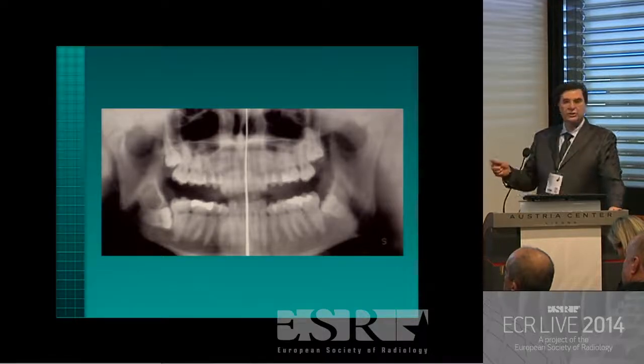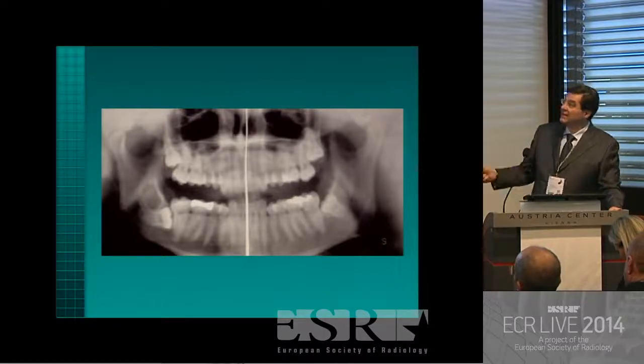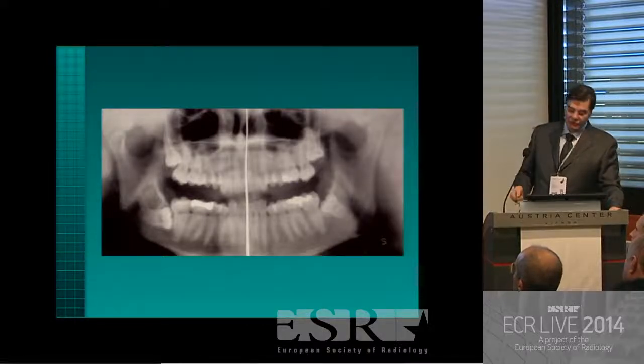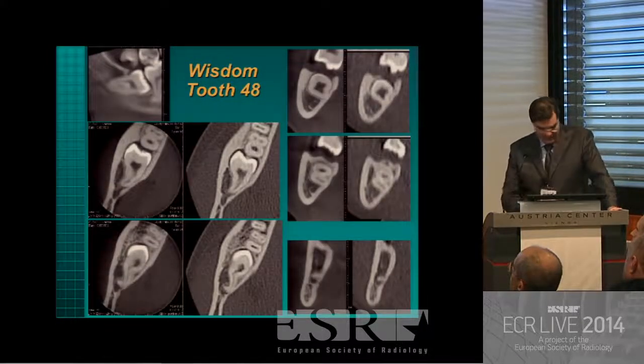It's just a combination of the mandibular canal, the roof of the mandibular canal, the lingual cortical bone, and the back of the dental sac, of the follicular sac, which is around here, which is a normal occurrence. And so in combination, it looks like it's a dental cyst.